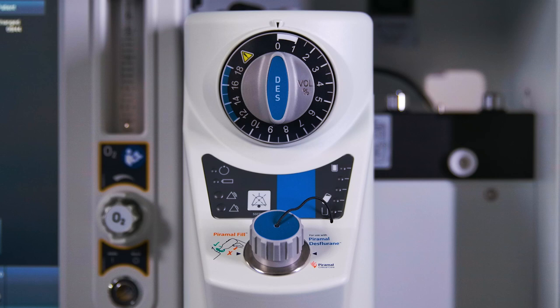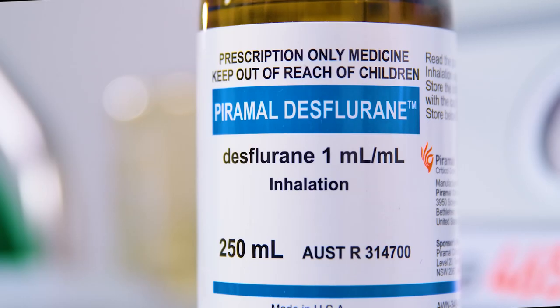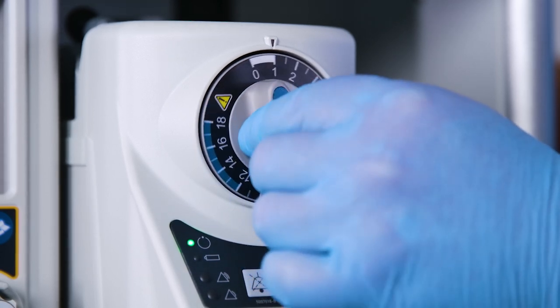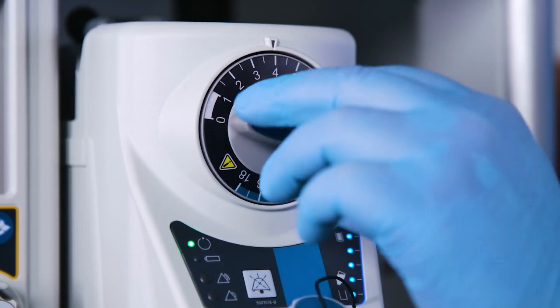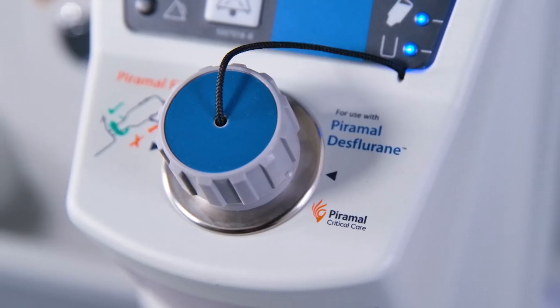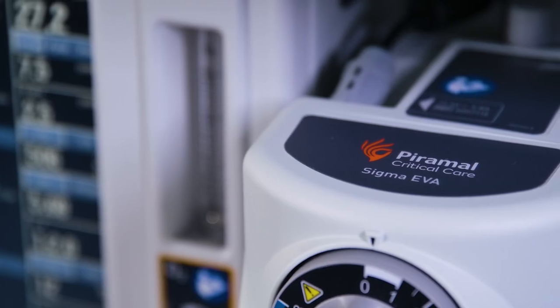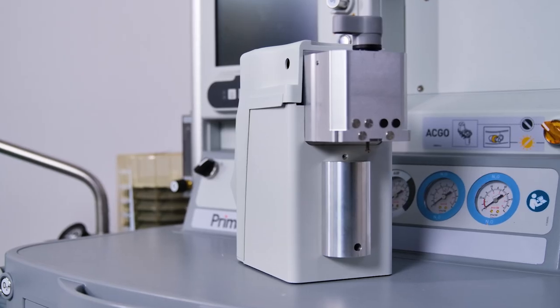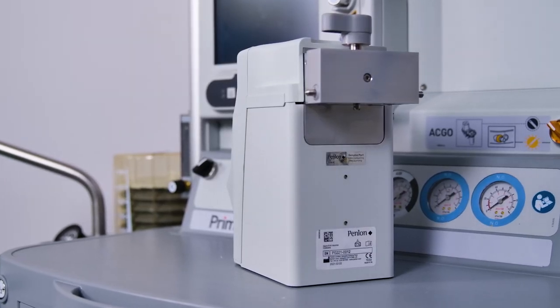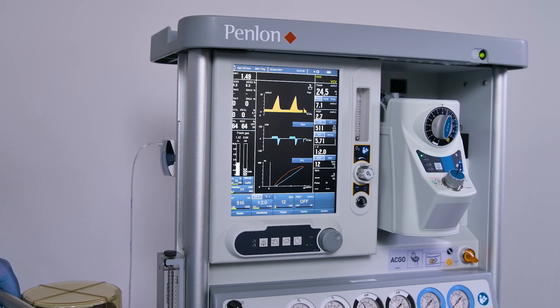The Penlon Sigma EVA anesthetic vaporizer is designed for use with desflurane anesthetic agent. The Sigma EVA has a single forward-facing rotary control dial to regulate the vapor concentration delivered. Alarms and status indicators are located on the front of the vaporizer. The Sigma EVA is available with the Pyramol Fill or Baxter SafeFill filling system, and with Selectatec or Draeger Auto Exclusion interlock back bars. The Sigma EVA is a mains-powered electronic vaporizer with battery backup.